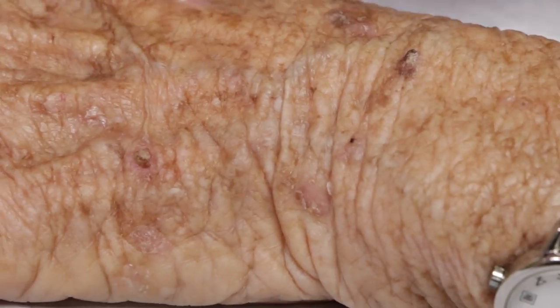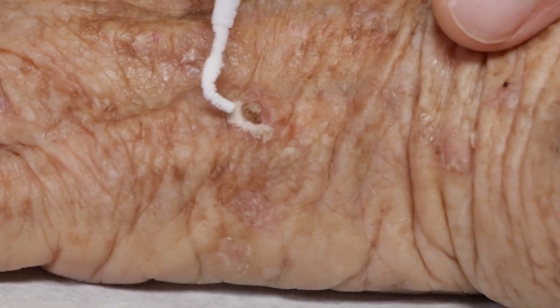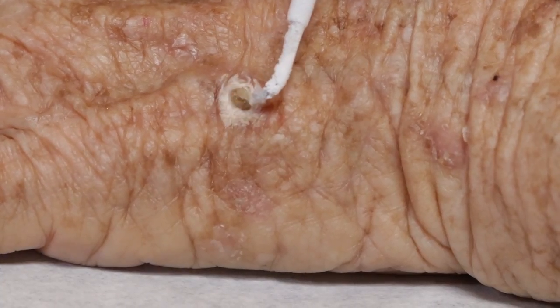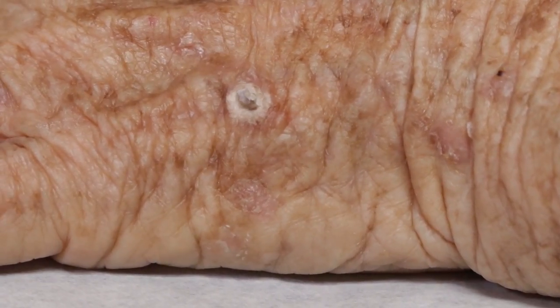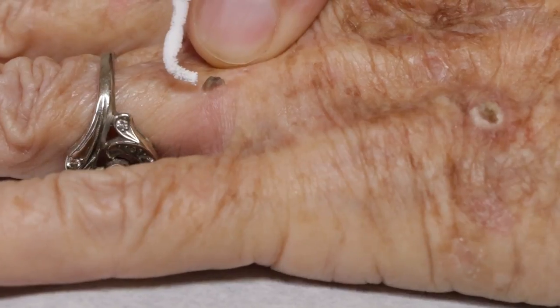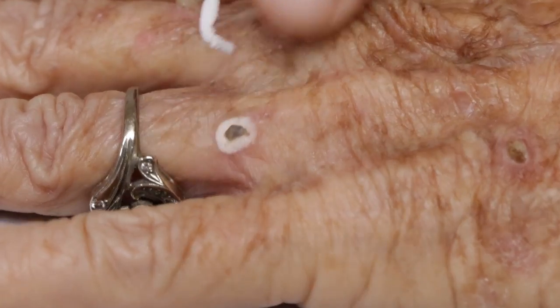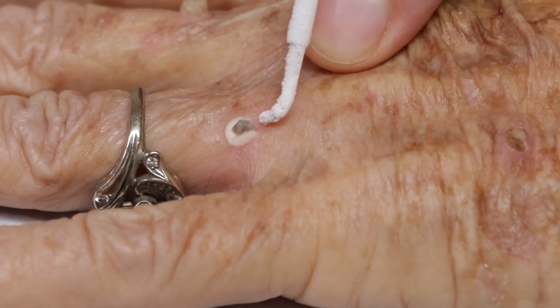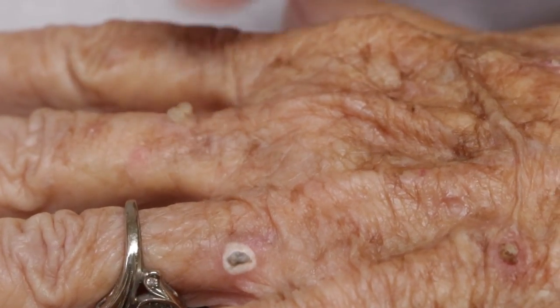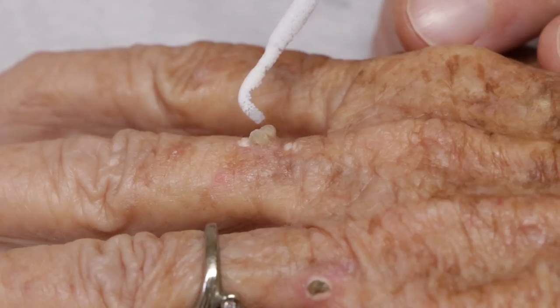Now we're going to hit them all a second time. Starting with this one. That one's gonna be cold for a while. Then moving on to this one — pulling it up and over so we can hit it with cold, get it from this angle too. So we want to knock these out; we do not want them to stick around. And then moving on to this one here — wow, that's the biggie. That is a big one. We may even have to do that one a second time, it's so big.